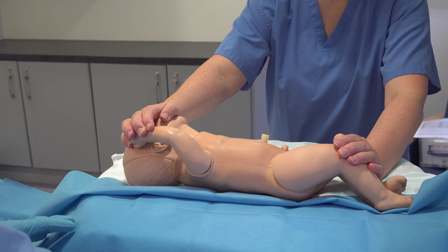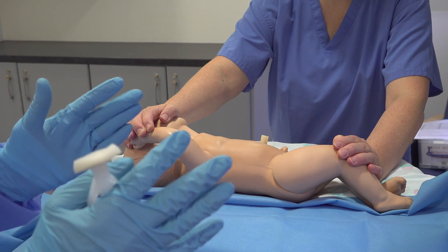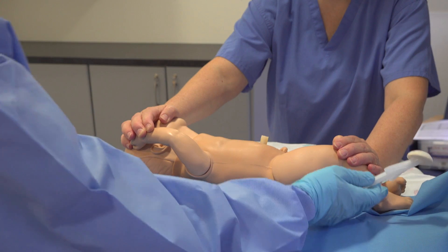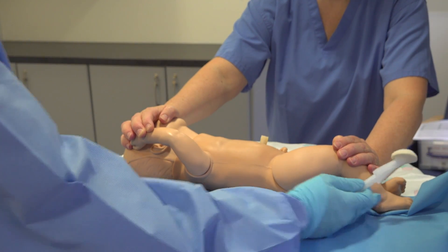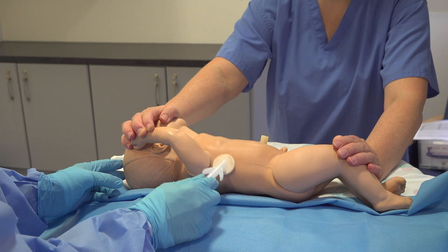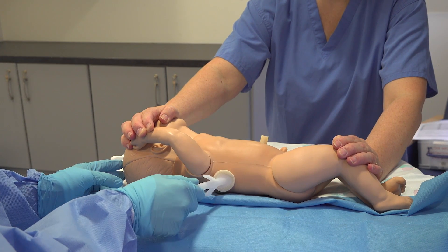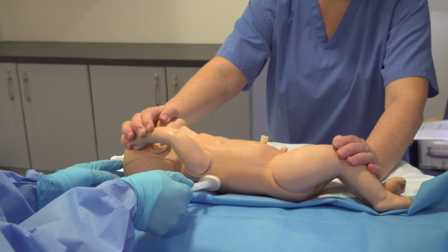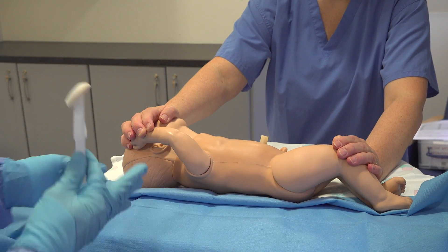So we've created a sterile field and you have scrubbed in your surgical gown and sterile gloves. We have our assistant holding the baby with the arm above the head, and we clean the area with appropriate cleaning fluid, creating a big sterile field. I'm waiting for 30 seconds.